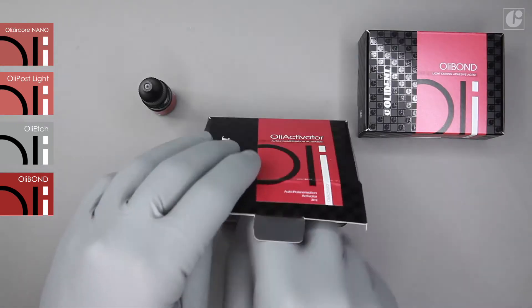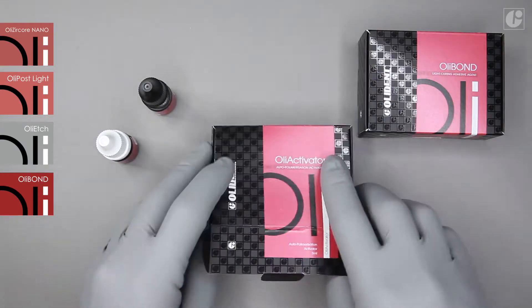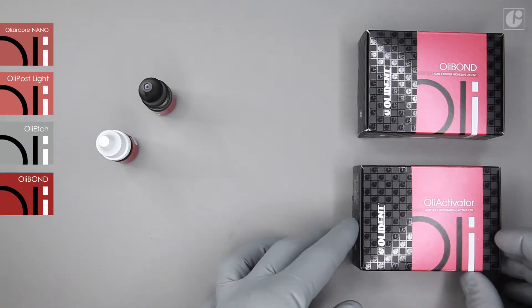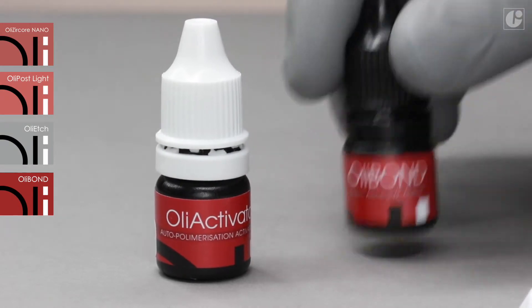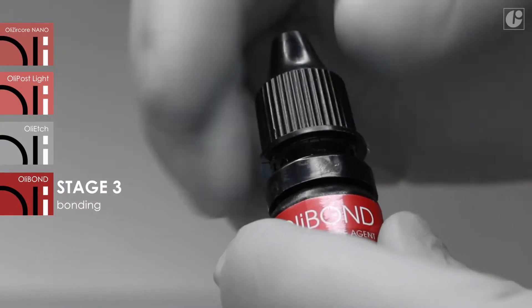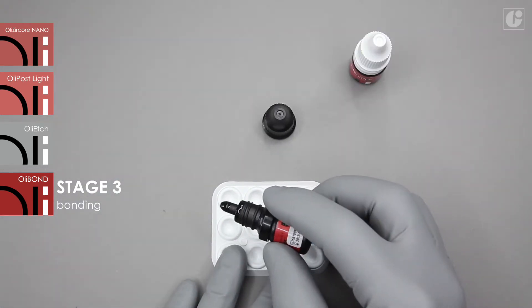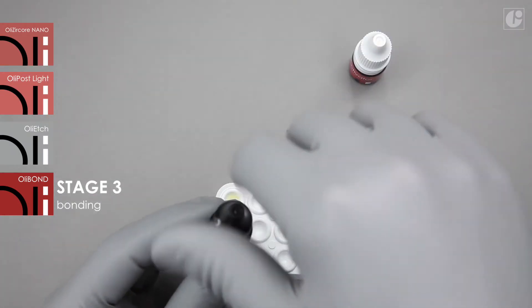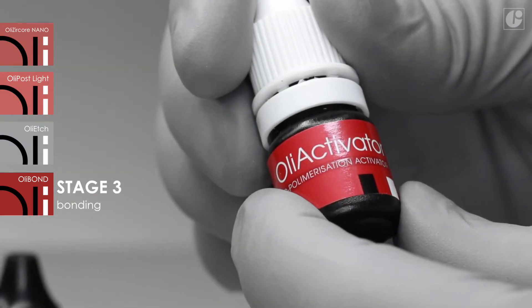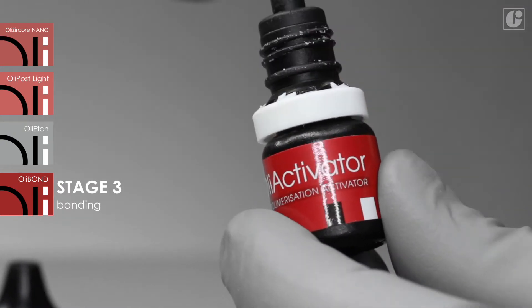You just need to add a special activator to the basic version of OliBond that will activate chemical polymerization. Such an OliBond–OliActivator mixture can be applied with self and dual curing materials, as well as during procedures where the use of light is limited or impossible. Chemical polymerization option in a root canal is absolutely mandatory.